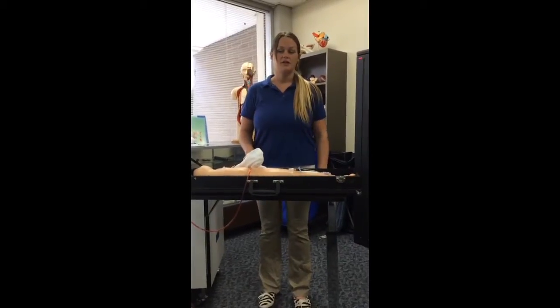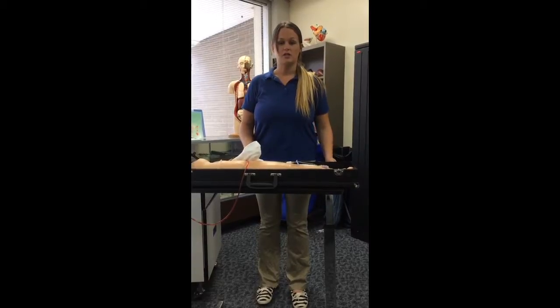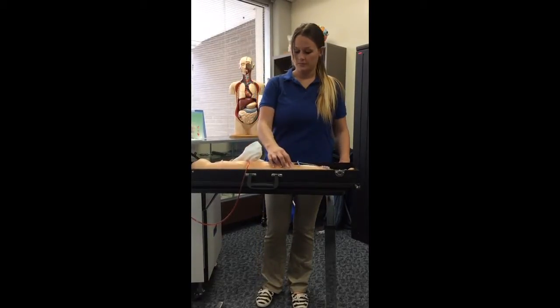Hi, I'm Natalie Kelleher. I'm in Section 7. I'm going to be performing IV medication through primary line.